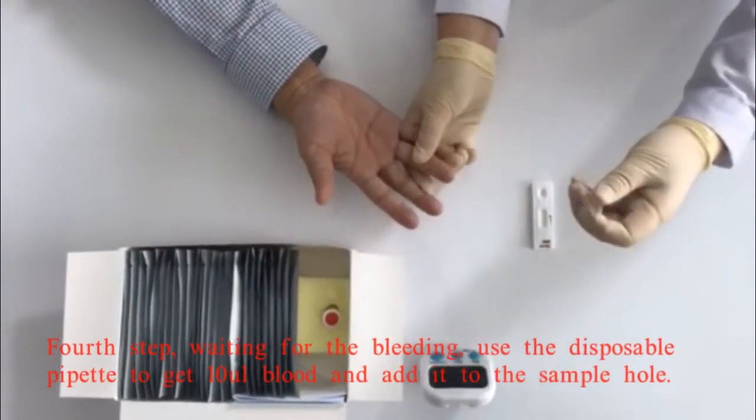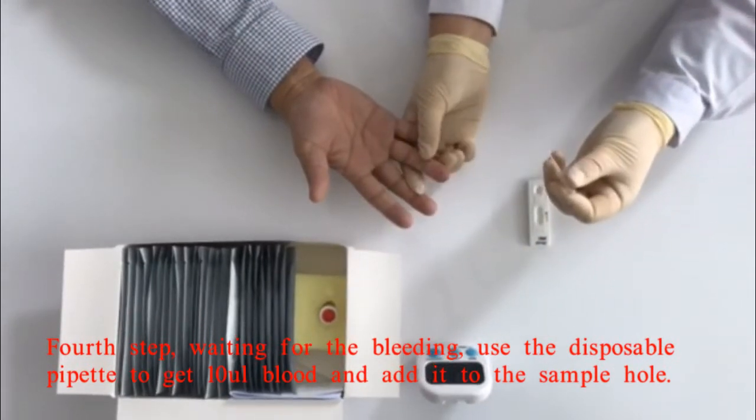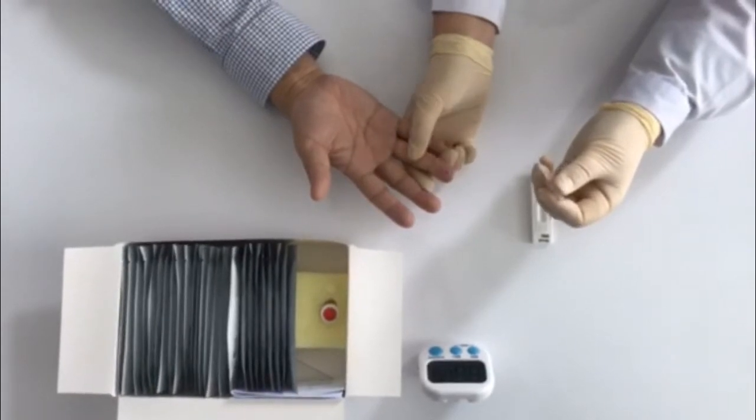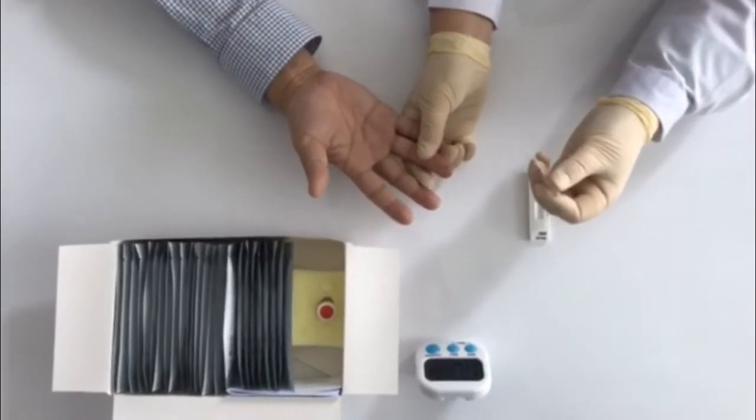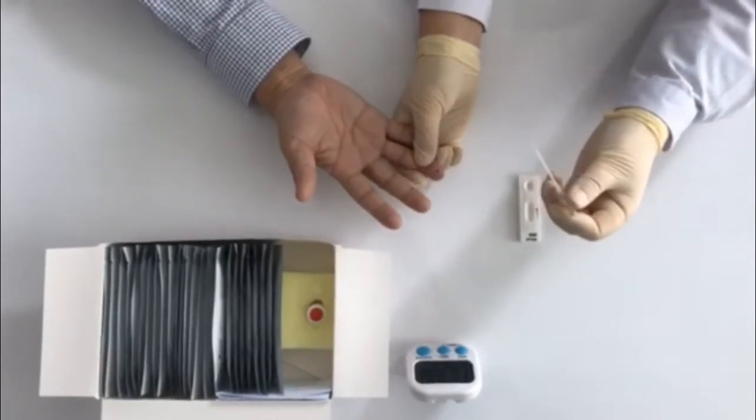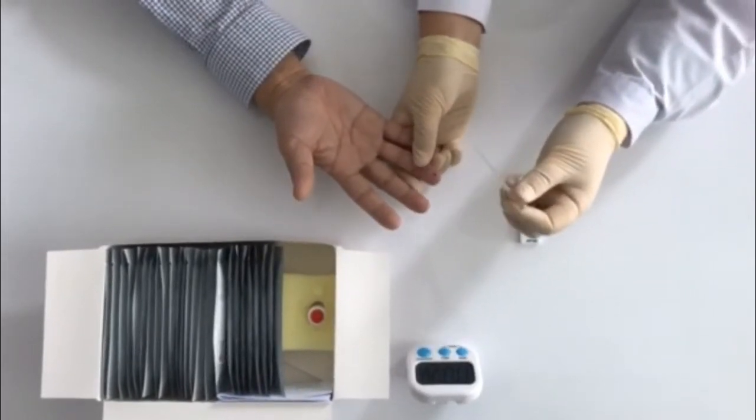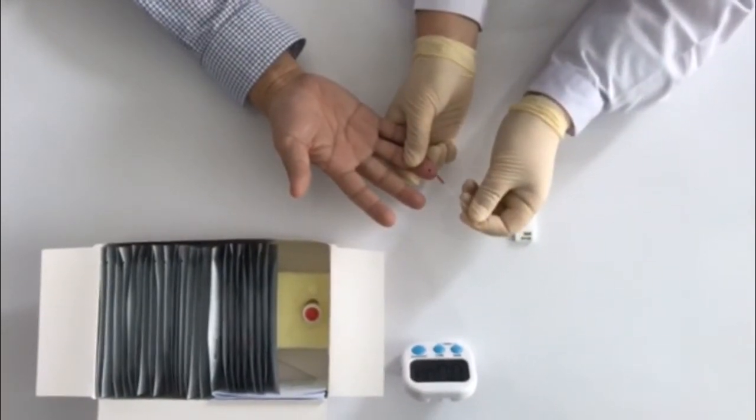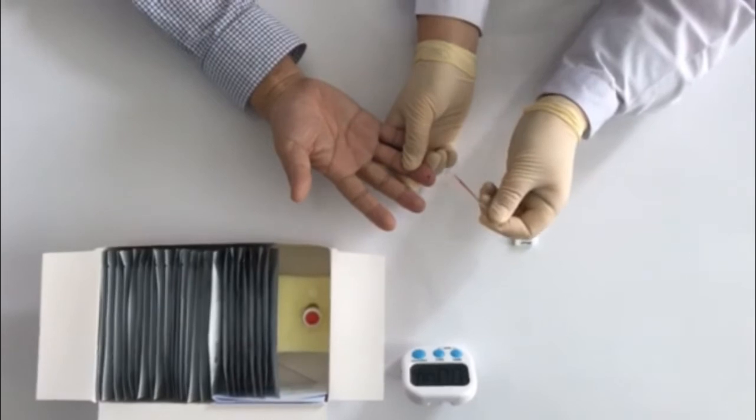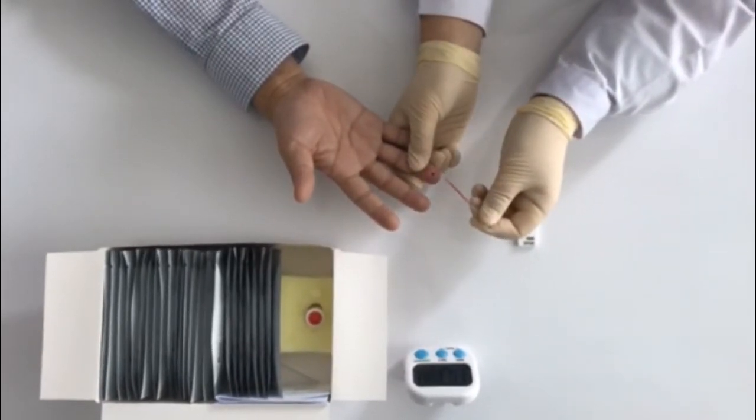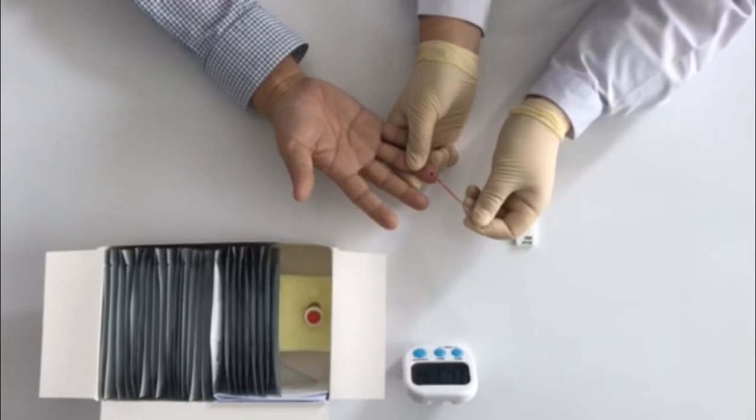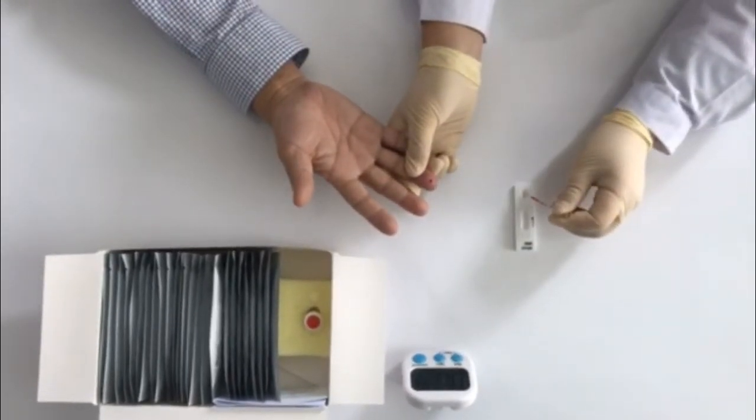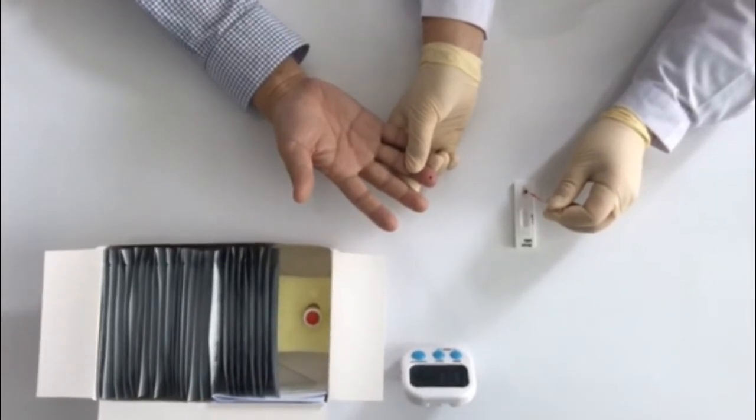Fourth step, waiting for the bleeding, use the disposable pipette to get 10 microliter blood and add it to the sample hole.